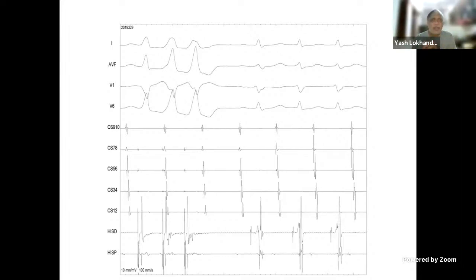What we were trying to show is that it is not a ventricular echo, it is an AV nodal re-entry echo. To identify that on the surface ECG is difficult. But if you see an R prime in lead V1, which is absent in sinus rhythm, or a pseudo S in lead 2, which is absent in sinus rhythm, you may think that there could have been an echo.